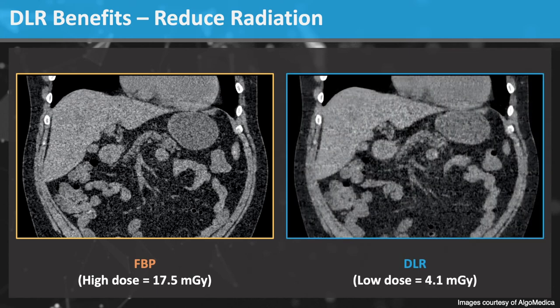However, with DLR, the noise from the low radiation dose scan is substantially reduced, leading to improved image quality that is comparable to the full radiation dose scan on the left. DLR is a revolutionary tool in image processing and allows for substantially reduced radiation dose.